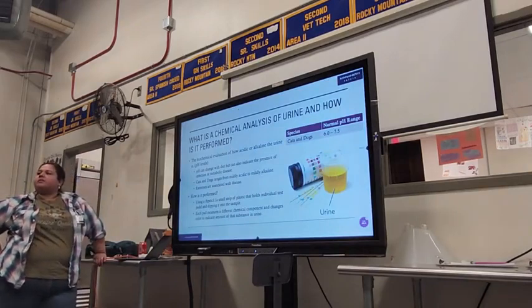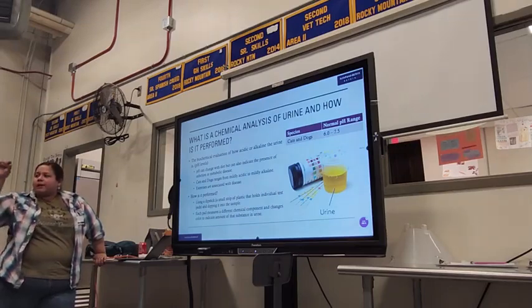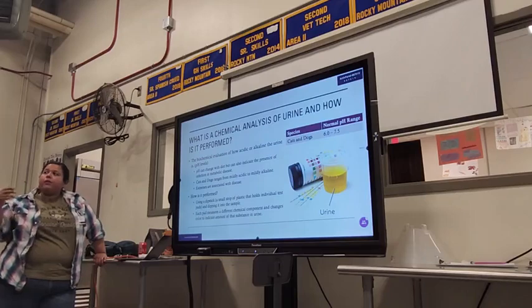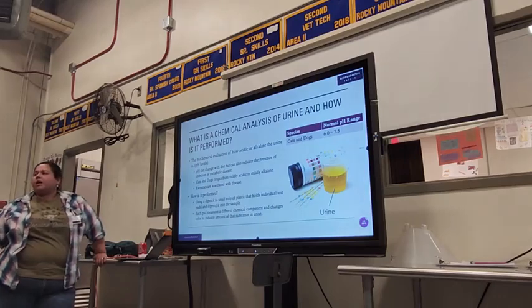30 seconds. Yes. You need to follow the timestamps that are on there, because if you read it beforehand, it's not going to be a true value. If you read it too long afterward, then chemical decomposition has taken place. So it's not an accurate reading.